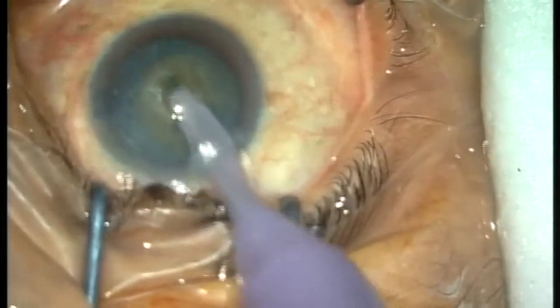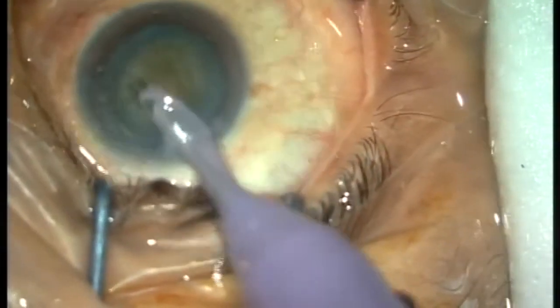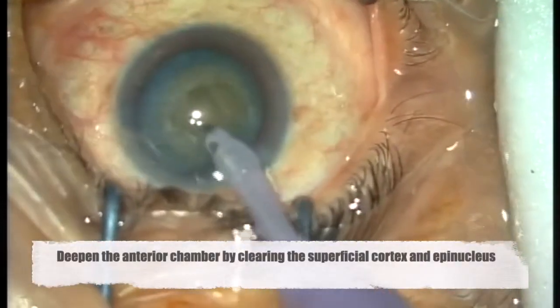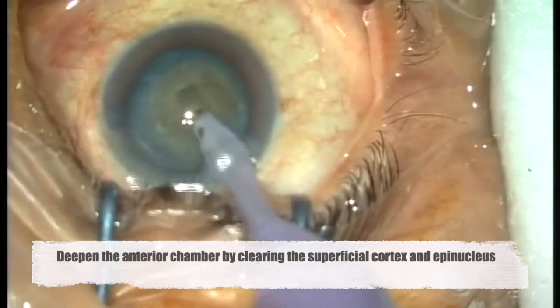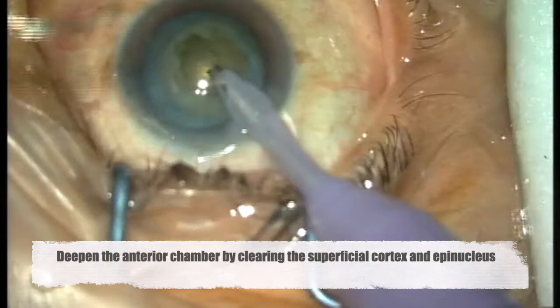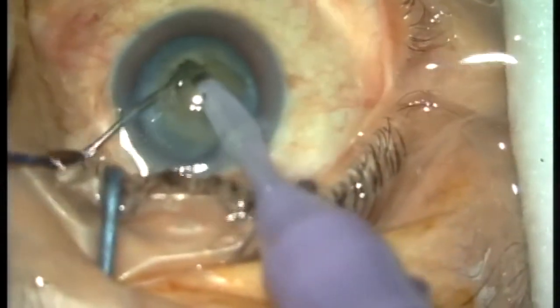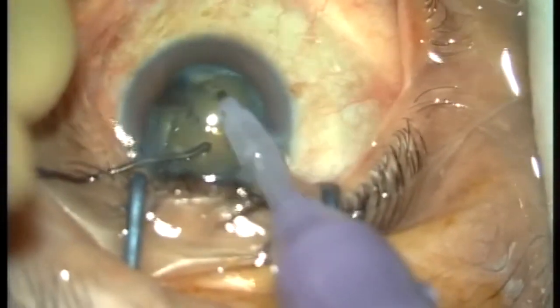Complete separation is needed in this case for safer manipulation. Once the floor is thin, separation of the nucleus is done. Again in hard cataract, complete separation will ease the subsequent process. Once completely cracked, we can consider the most difficult part of the surgery half done.